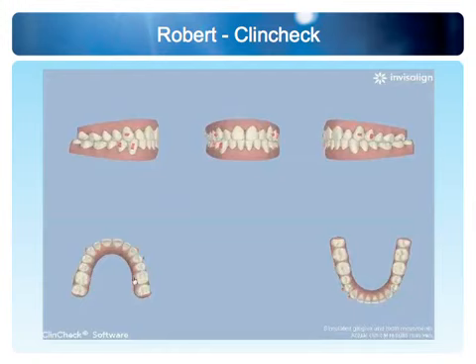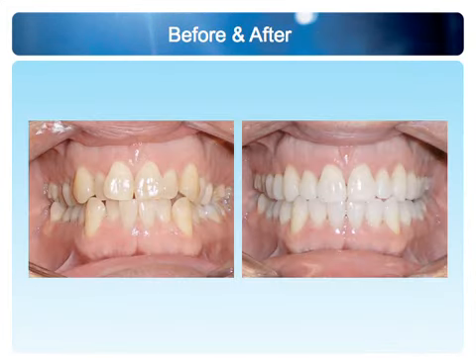These are about 8.8 millimeters central incisors, so with the 32 transverse measurement, having had some IPR, he has the right arch width and the right arch form. And upper laterals flow to position beautifully. Now this case was 20 aligners. We used 20 aligners, and then I used 8 for refinement to make it perfect. And we finished him here.